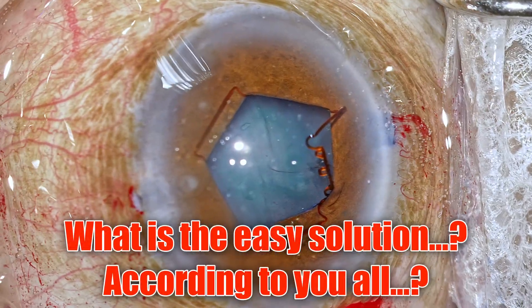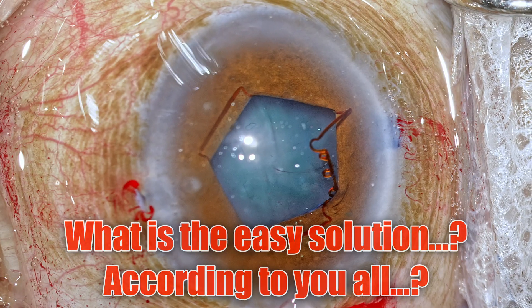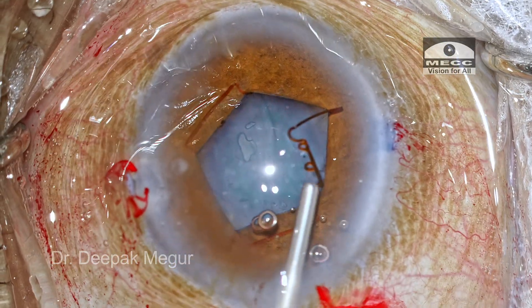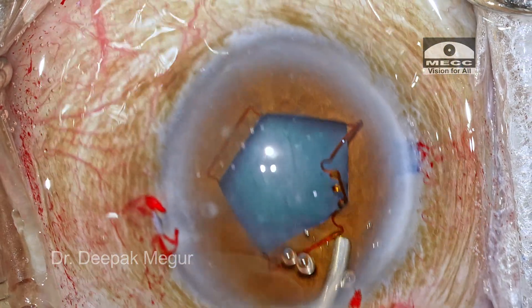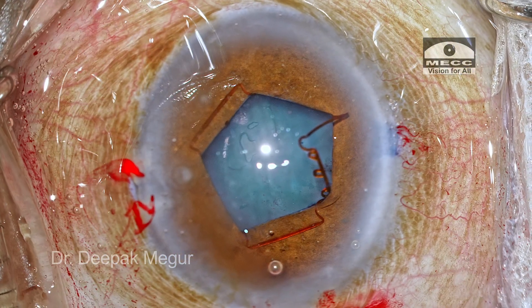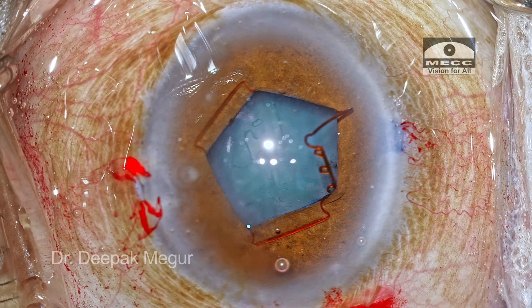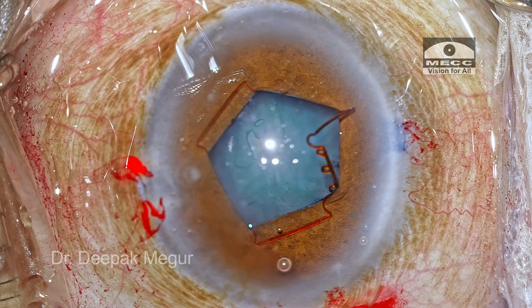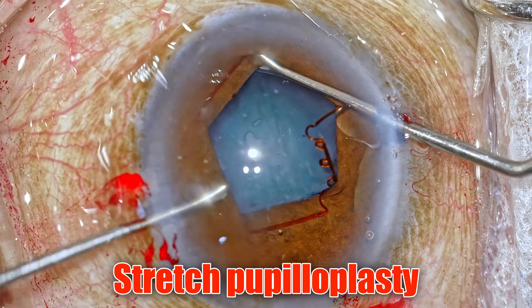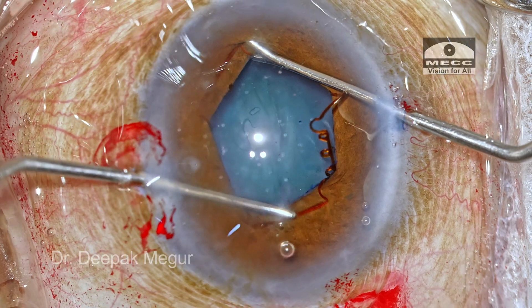So what is the easy solution? I'll pause the video for you to think. The first thing to do is not to panic — this is not a big deal at all. We are unable to engage the last two notches simply because the pupil is too rigid for this thin device. What we need to do is perform a stretch pupilloplasty at this stage itself, and we can do it with the BX device already on.